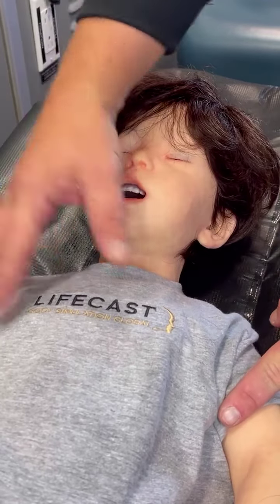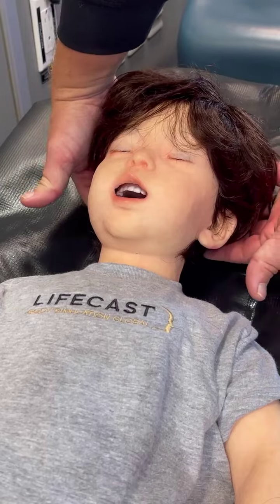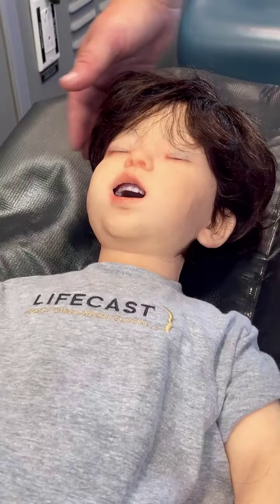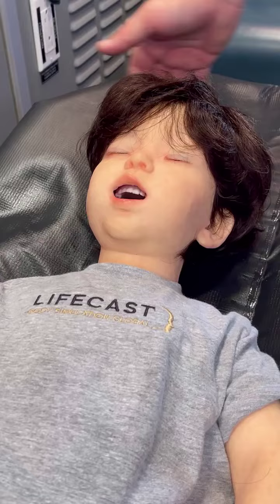An important piece to remember when ventilating a child is that the occiput of the head — this area in the back — is actually very large. It has quite a bit more depth than the shoulders themselves. So when a child is laying flat, you'll notice that the chin is tucked kind of into the chest.